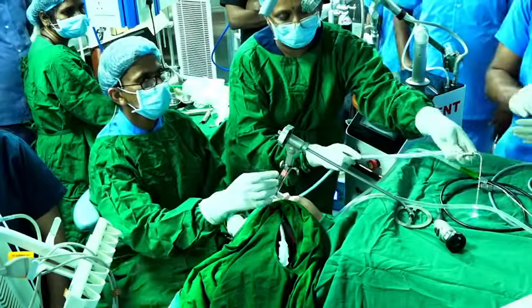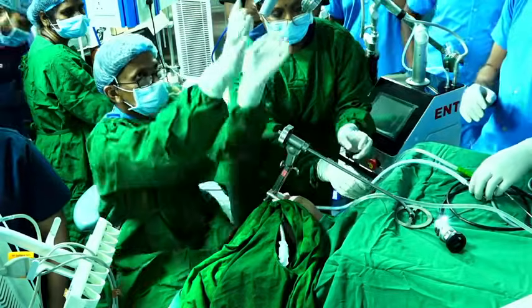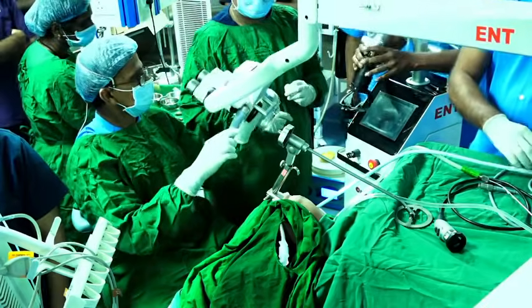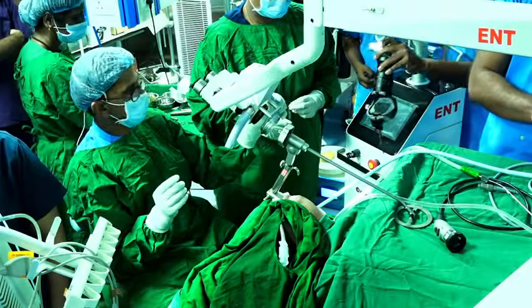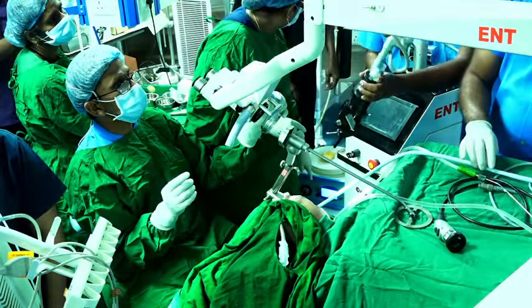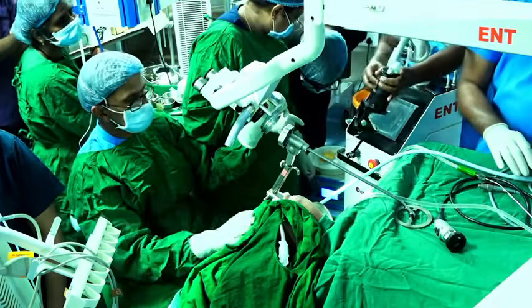But many textbooks say that both lesions should not be removed at the same time to avoid a web. But you can make a different incision and remove. Make a flap; your incision will vary, sir. You preserve the medial most part of the mucosa on one side. If you preserve it well, then on the other side you can go ahead and do it.